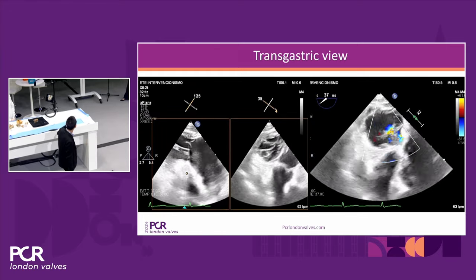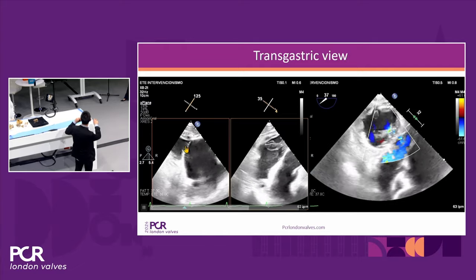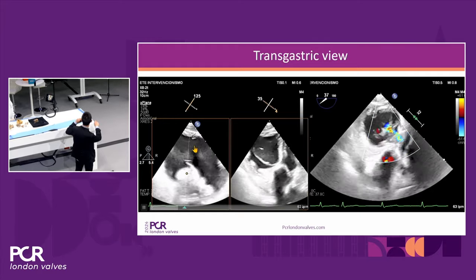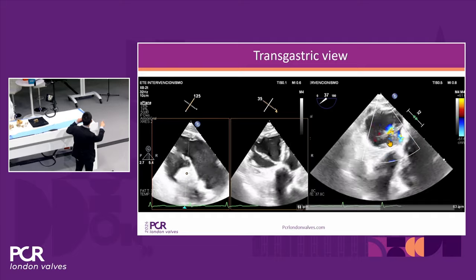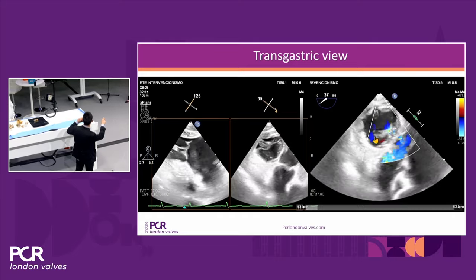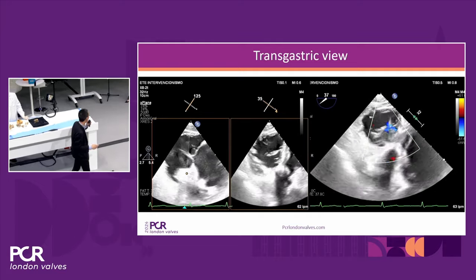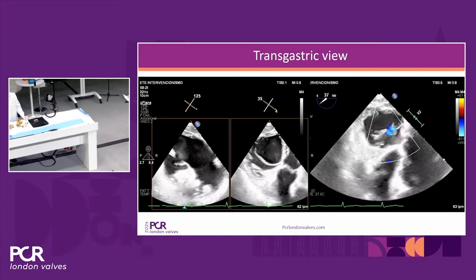And then we move to the transgastric view. In this transgastric view, it's important to identify this papillary muscle to separate the anterior part of the valve and the posterior part of the valve. And we can see clearly this jet is central, but probably slightly posterior. And this is the anatomy. So the idea here is now to move to the anatomical.